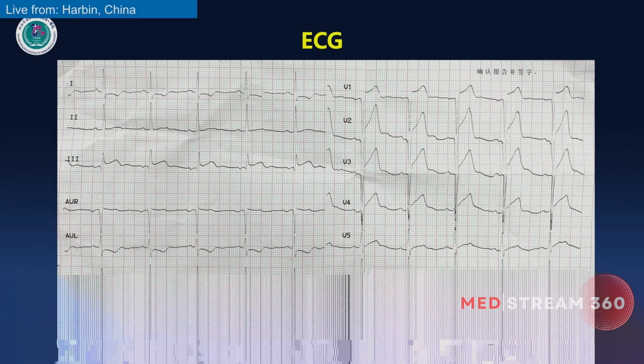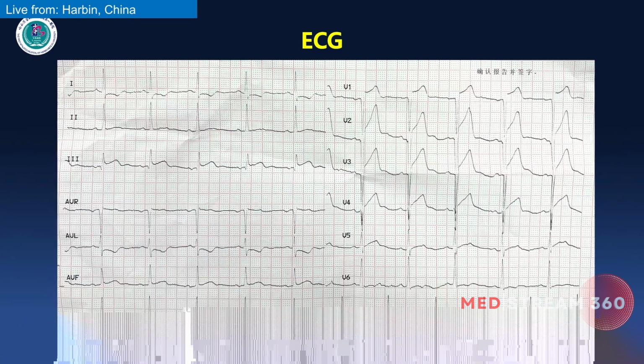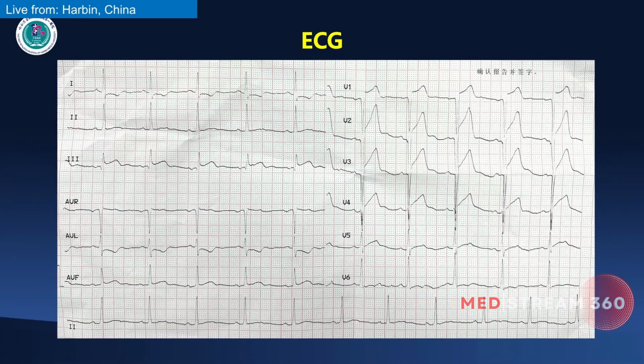This is the electrocardiogram. From this picture, you can see a Q wave in V1 to V4, and elevated ST segment in II, III and aVF. Depressed ST segment in I and aVL.